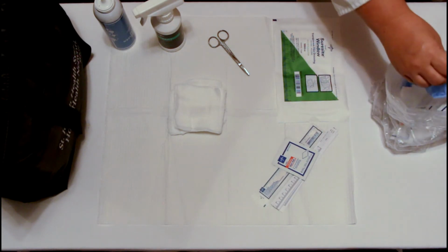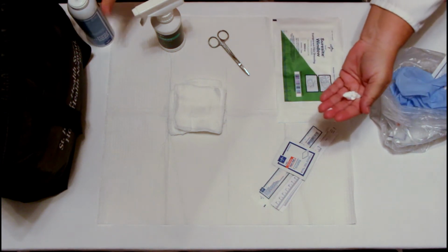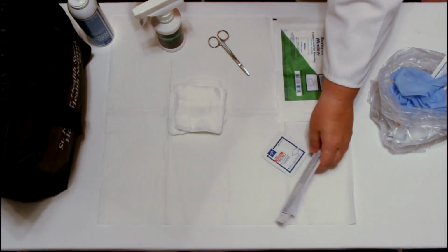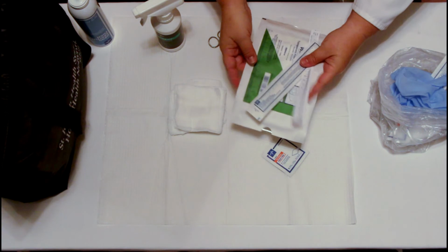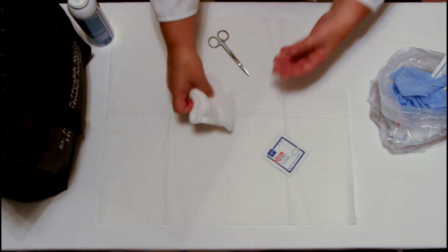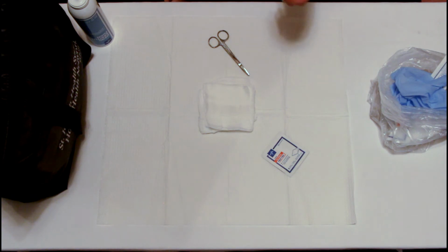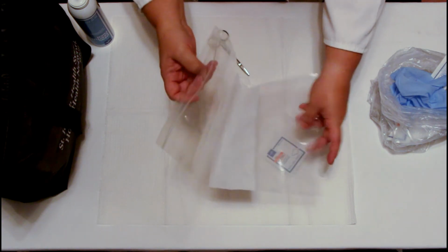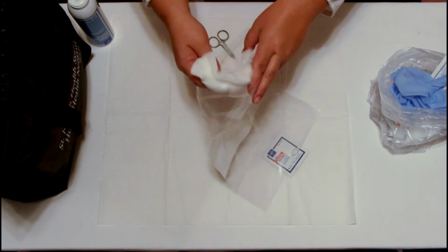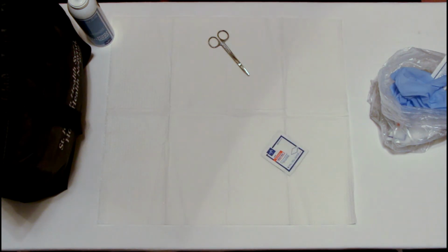The gloves are removed and disposed of, and hand hygiene is performed. The clinician then replaces the items that are remaining into the patient's supply box. The leftover bulk gauze is not returned to its original packaging. Instead, it is placed in a clean baggie and sealed and placed away for future use.